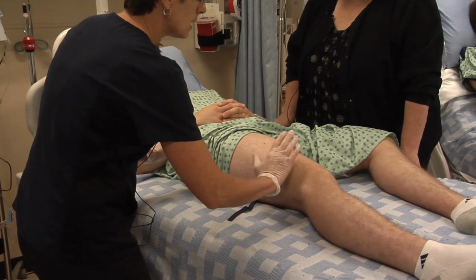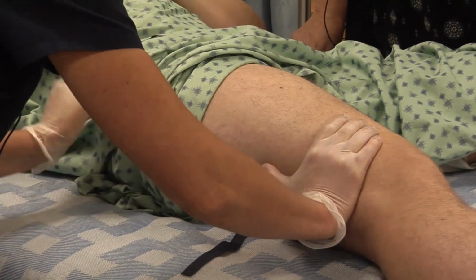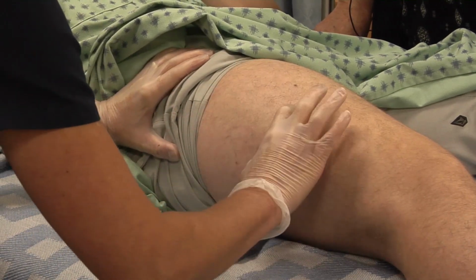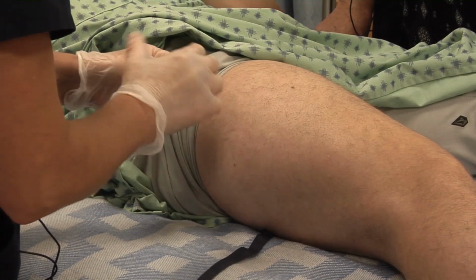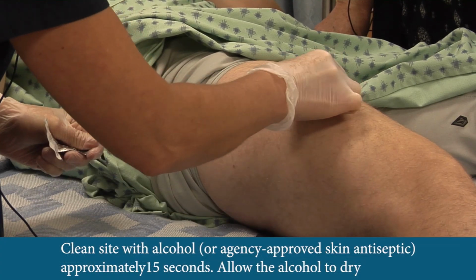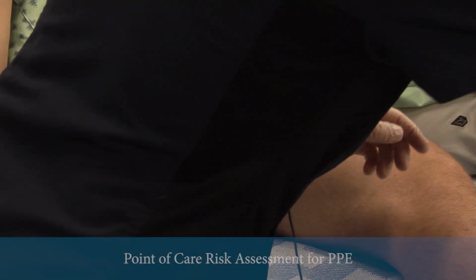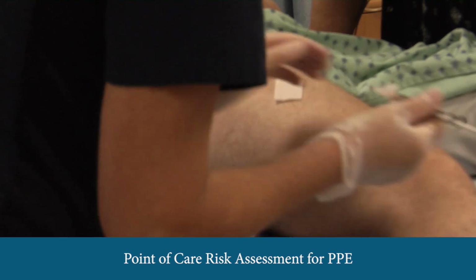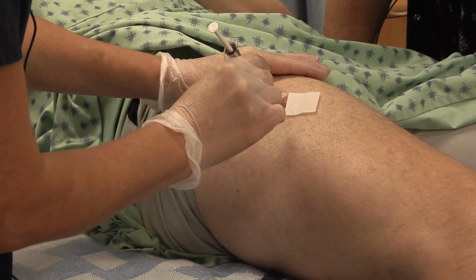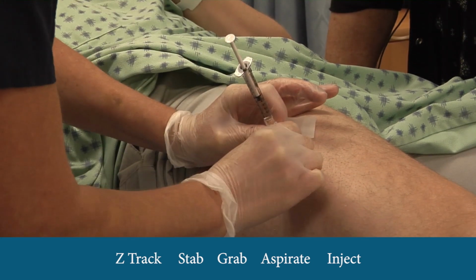In terms of landmarking, I look about where the knee is and landmark there. I think about the greater trochanter and I landmark there. And I'm going to go in the middle third of the muscle, which will be here. Okay, so I'm going to use my alcohol swab, clean from the inside out. And now this time we can leave the corner of the alcohol swab pointing to where I want to actually do the injection. That's handy. Yeah. Okay, so now I'm going to Z track again. So again, it's just slightly displacing the tissues. Stab, grab, aspirate, inject.